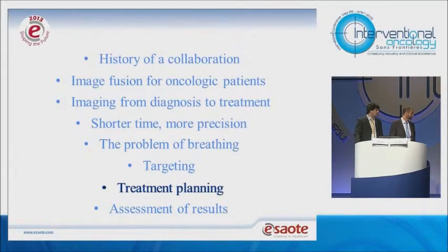So in those cases, you need some features to help you understand where to go and where to reinsert the needle when one single introduction does not cover the entire volume. And this was done for years in our experience just manually, just with our eyes and experience. Now it's no longer like that.